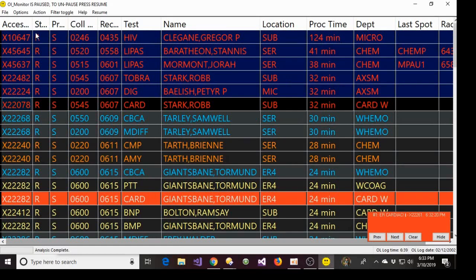Anyway, let's see what else we can do. So another time that you might want a pop-up message. Oh, and here we go. There were two cardiacs that matched, so you can see that it's listing both of them.